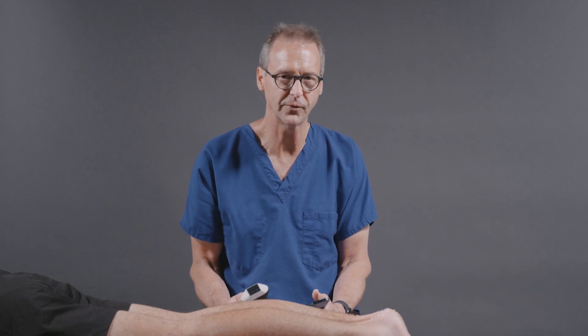It really doesn't take a lot of time to do this examination, and you really don't need to do much in the way of other types of imaging. If you discover the injury, you can go ahead and immobilize the foot and ankle and refer the patient to orthopedics for a repair.